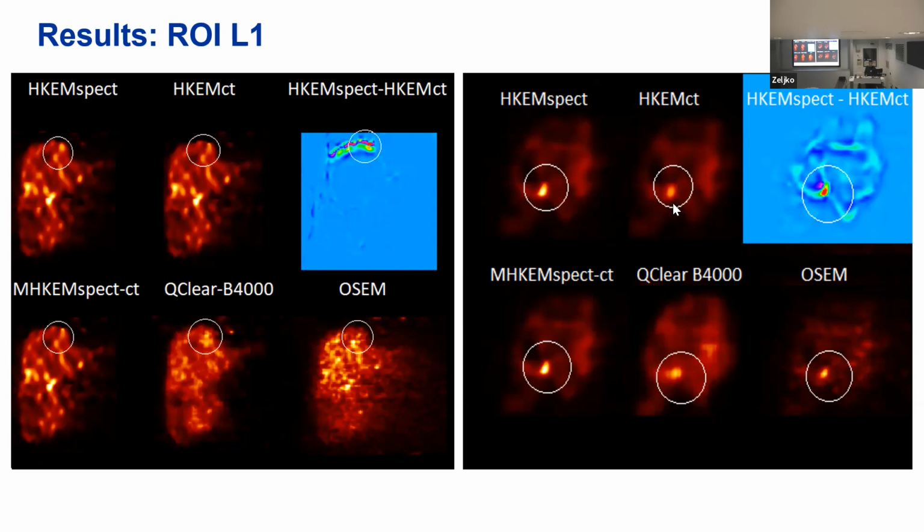And on the other patient, the lesion is a lot bigger, so it's not as much affected, although the contrast difference is quite visible. But what is interesting is that whenever we use PET and CT information, for this patient, we see this deformation, and for this one, we really don't.